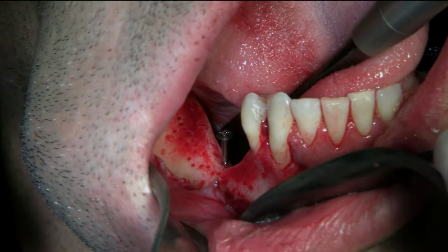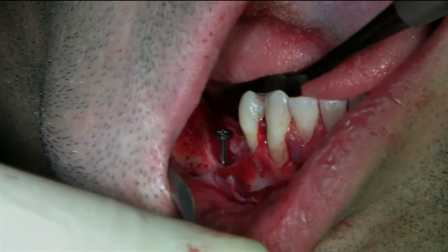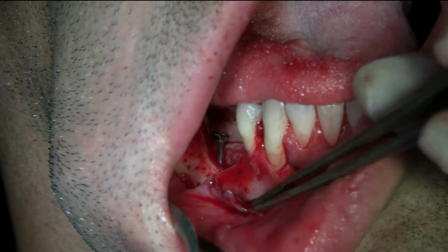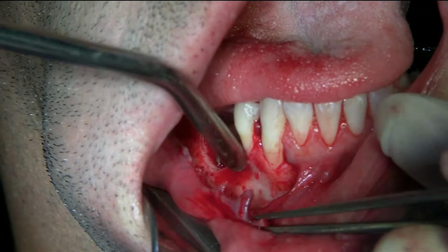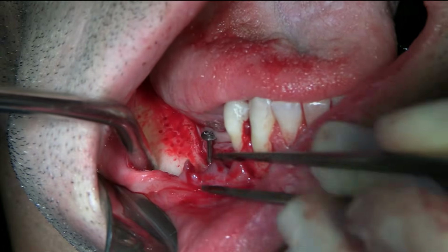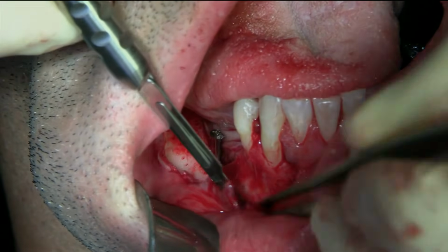So what we have to do is you just hold this one here, just the cheek. Okay. 15. Do you need to hold the lingual? No. Let's release here. So I'm going to take the buccal flap. We need to suction. And I'm going to the base of the flap to start to release it. Got to keep it nice and dry here.